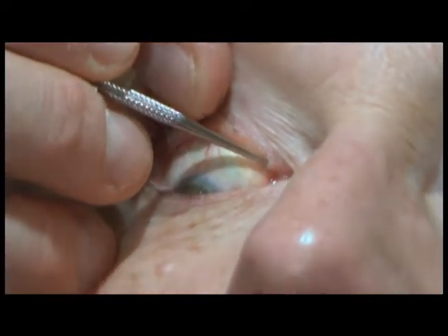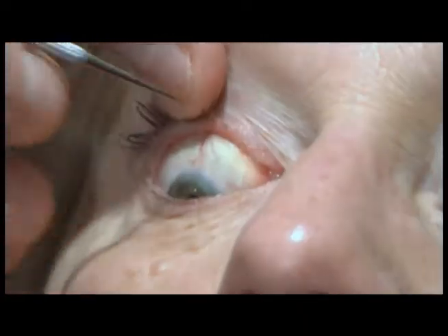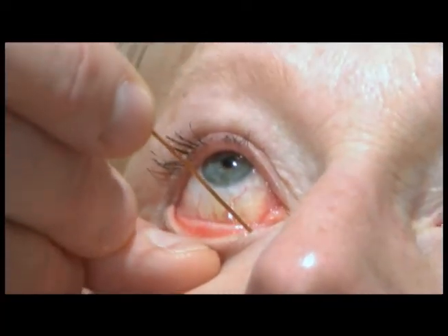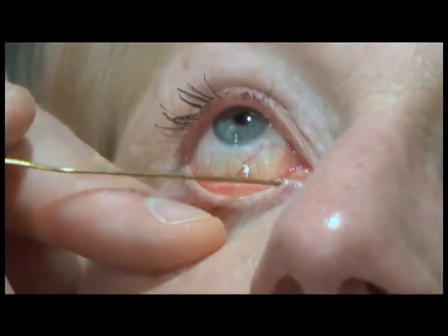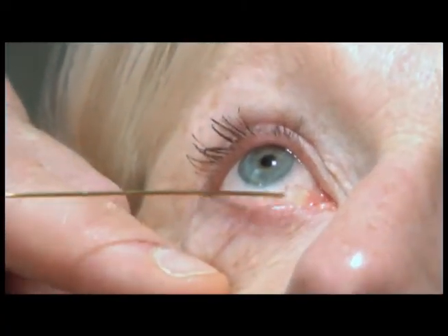The patency of the canaliculus is assessed using a Bowman probe — usually a zero Bowman probe. The probe is placed vertical followed by horizontal, then advanced along the length of the canaliculus to palpate for any evidence of obstruction or soft stop. The same is then done for the upper canaliculus.